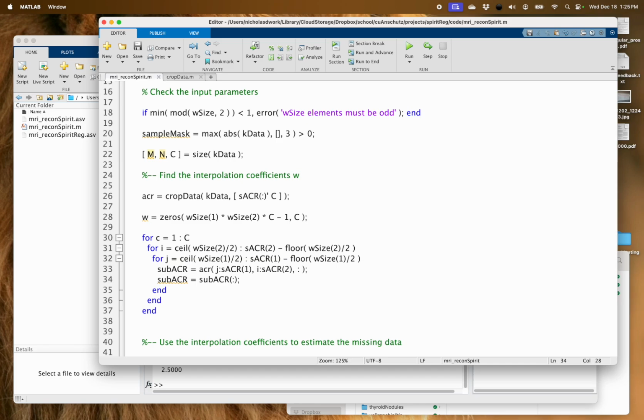We have to get rid of it in some sense. We could either eliminate it from this array, or we could set its value to 0, and then when it gets multiplied times w, we would remove this -1, and then we'd eliminate that value of w afterwards. I guess it doesn't really matter. We got to get rid of the thing anyways.